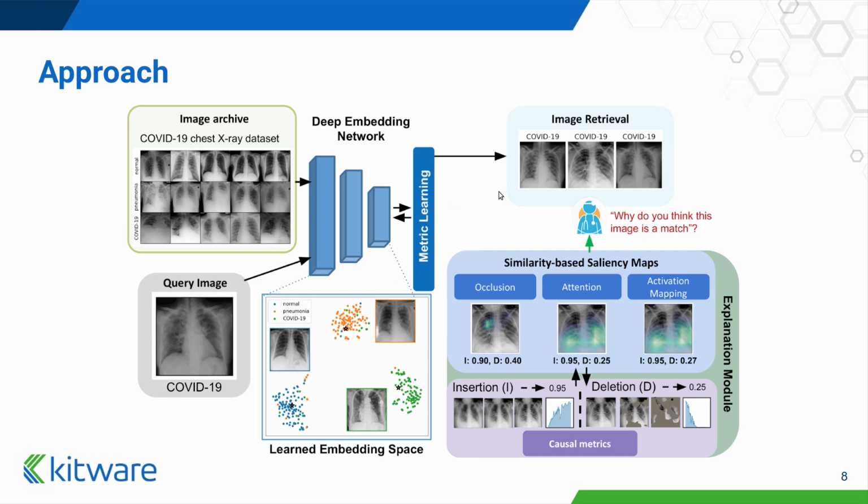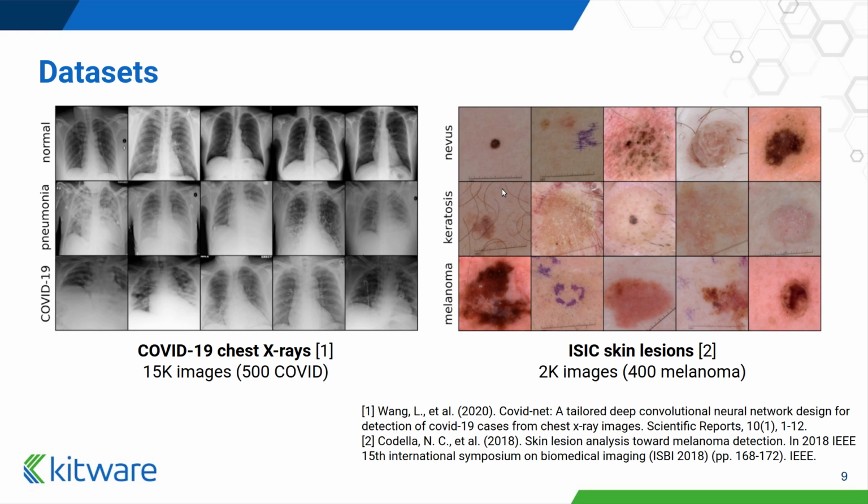In our work, we focus on two different medical imaging datasets. One dataset involves chest x-rays, including those with COVID-19. The other dataset involves ISIC skin lesion images, including those with cancerous melanoma.